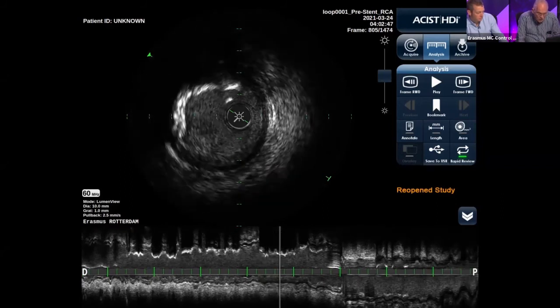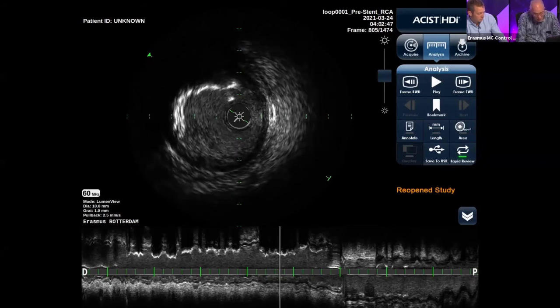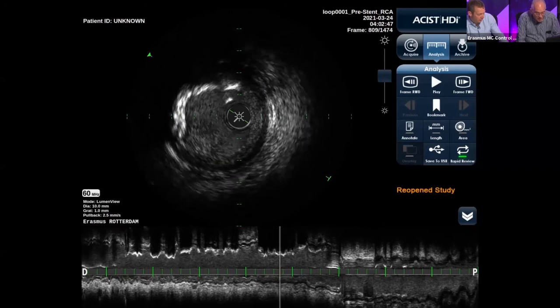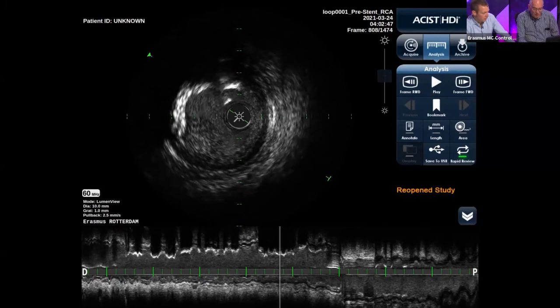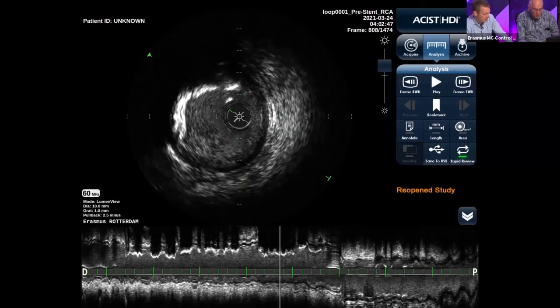So, and then if we go more proximal, then you see at 8 o'clock this mass, and I think everyone will recognize it by now that there is some subacute thrombus there. You see the lumen, and in the lumen you can see the speckling, and the subacute thrombus is against the wall in here, between 6 and 9 o'clock. Yep. Here you can see the cauliflower of thrombus. I will center the vessel and brighten the picture a little bit. Yeah, now you can better appreciate it.